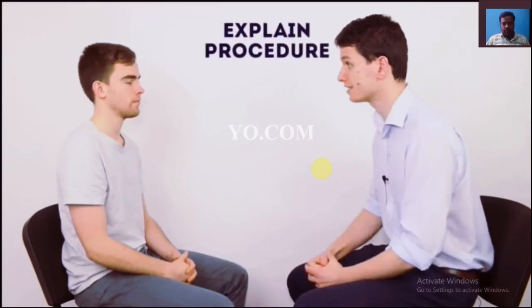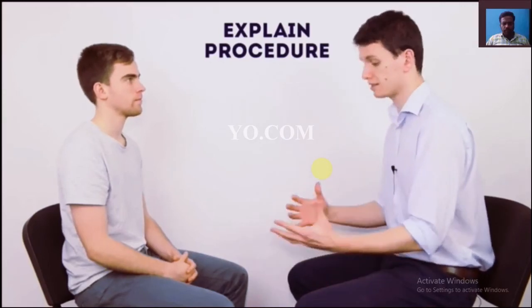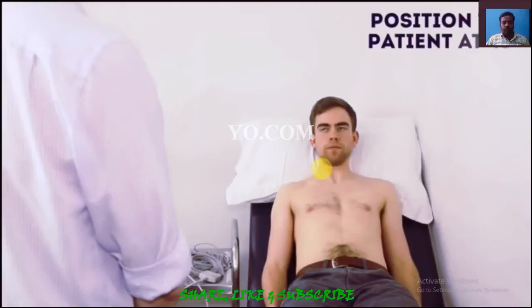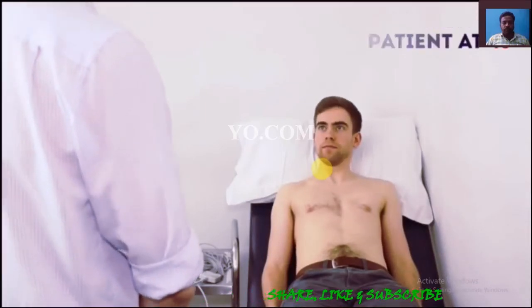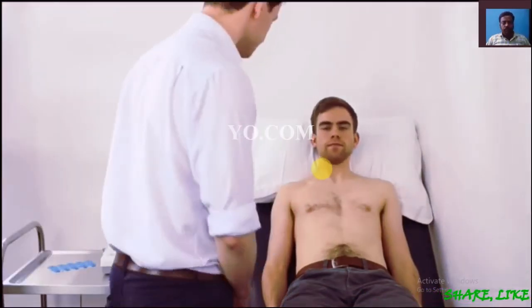Hi there, I'm David, I'm one of the medical students. Thanks for coming in today. Can I just confirm your name and date of birth? Sure, it's James Alexander, 30th of December, 1989. Okay, James. I'd like to do an ECG today. It's an electrical tracing of your heart. It's going to involve me placing some sticky pads on your chest, arms and legs, and measuring the electrical activity of your heart. Would that be okay? Yeah, sounds fine. For this, I'm going to need you to take your top off and just lie down on the couch for me. Is that okay? Yeah. Good. Are you comfortable where you are? Yes, sir. Do you have any pain in your chest at all? Okay, I'm just going to start by feeling on your chest to work out where to put these leads.